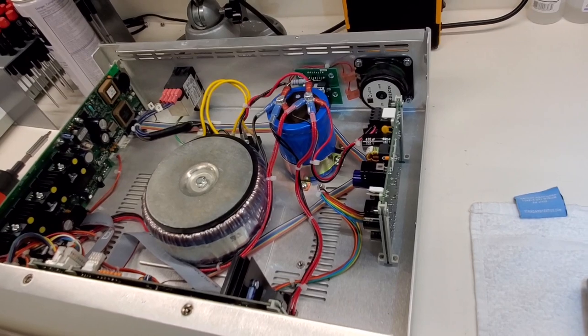So that is it, guys. That is the anatomy of a failure. And unfortunately, there's nothing I can do about it this time. But at least you guys know a little bit more about what's going on inside one of these beautiful little devices.